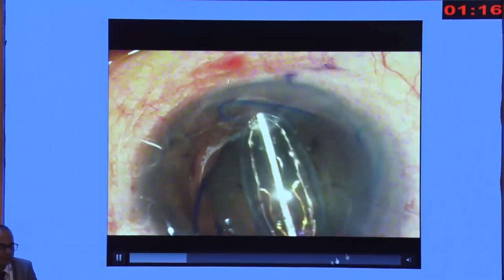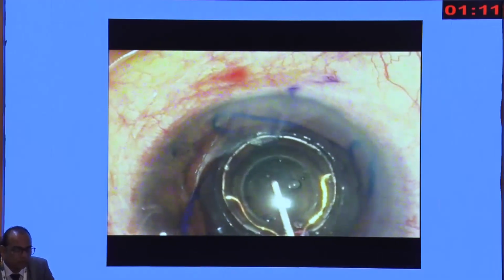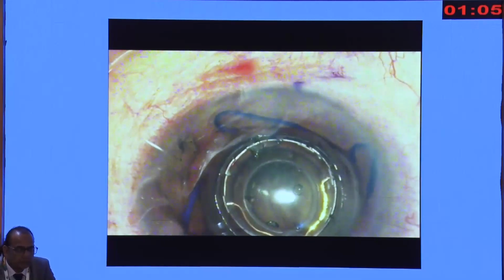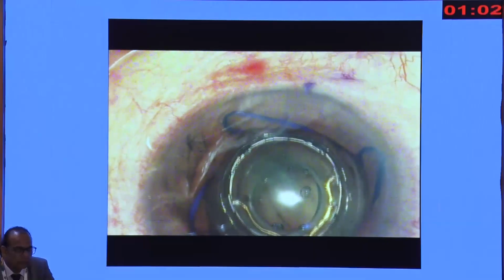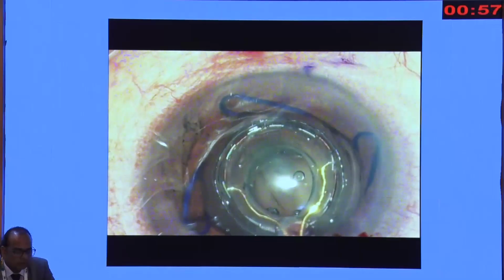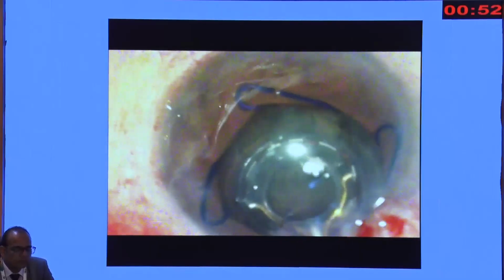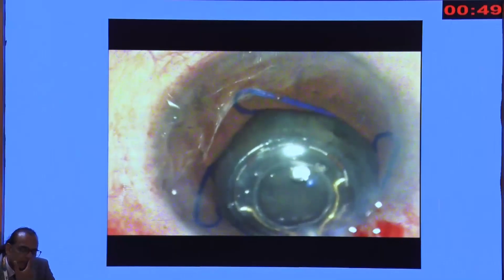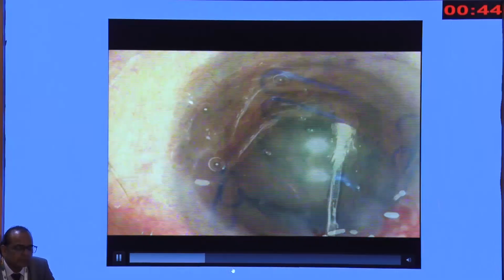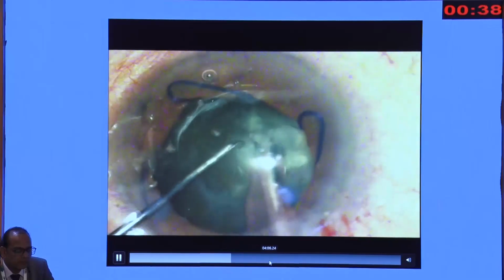A Zepto handpiece is then inserted to achieve a central 5 mm capsulotomy. This does not cause any stress on the zonules and a perfect capsular axis is achieved very easily. The Zepto handpiece is then taken out. Hydrodissection is done and the shaded quadrants are emulsified.